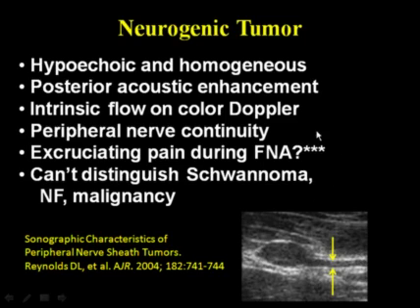One of the things that I have used as diagnostic, if I haven't prospectively thought of this lesion, is that whenever I've biopsied these lesions, the patients have had excruciating pain during the FNA. And again, remember that you can't distinguish schwannoma from neurofibroma or any of these malignant neurogenic tumors with ultrasound.